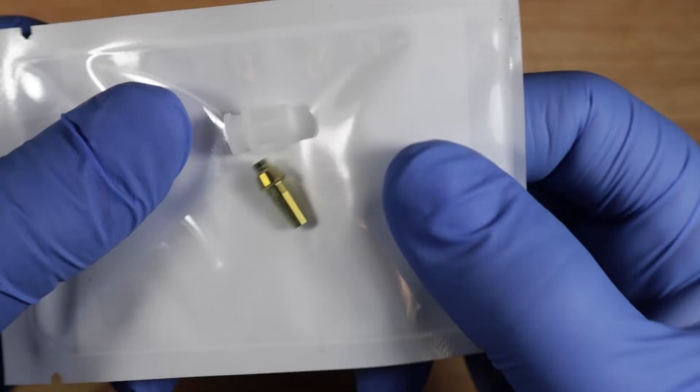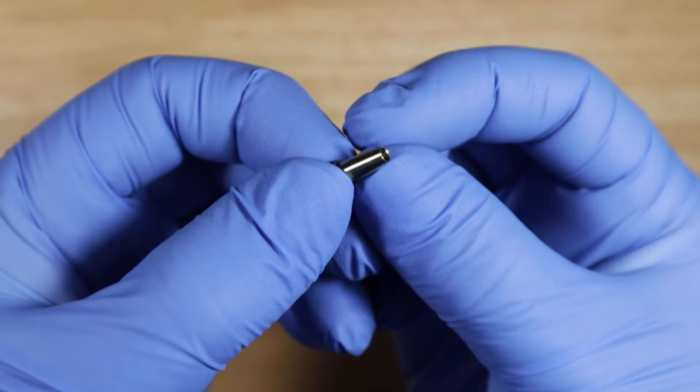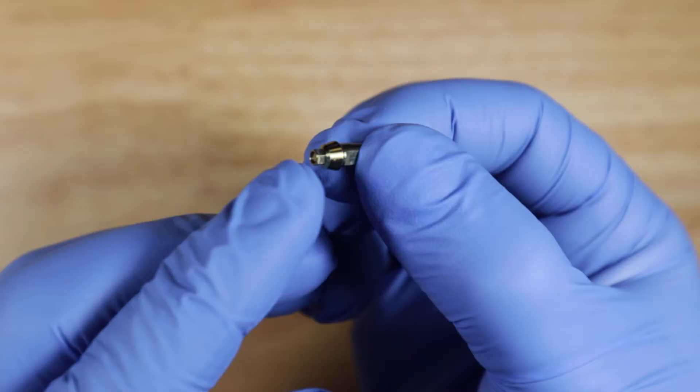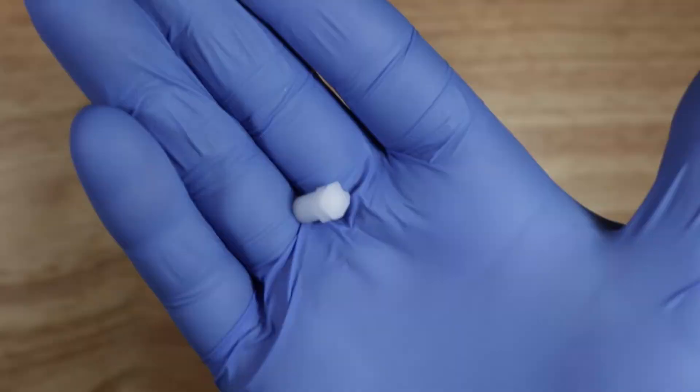What we have here is the closed tray impression coping. Let's open it up and take a look. This gold piece is a tapered cylinder — it's round on top and has one flat end. This side sits on the implant, this side sticks out, and there's a short screw inside, as opposed to the long screw that's in the open tray impression coping.